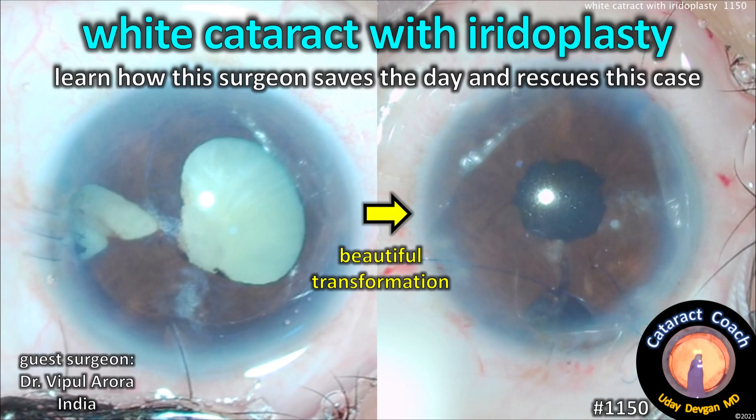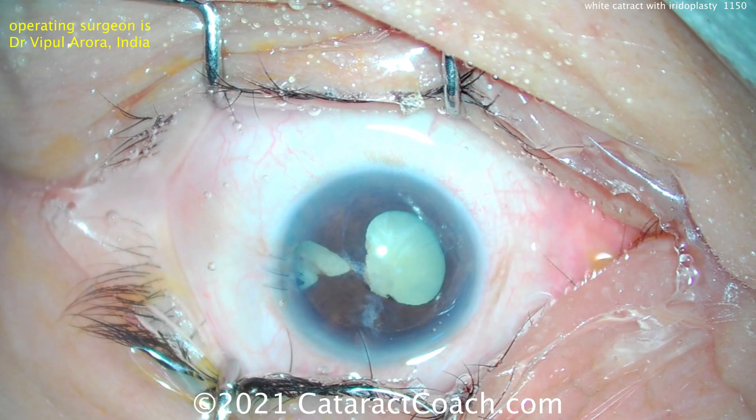CataractCoach.com presents white cataract with an iridoplasty. Learn how this surgeon saves the day and rescues this case. Our guest surgeon is Dr. Ripul Arora from India.